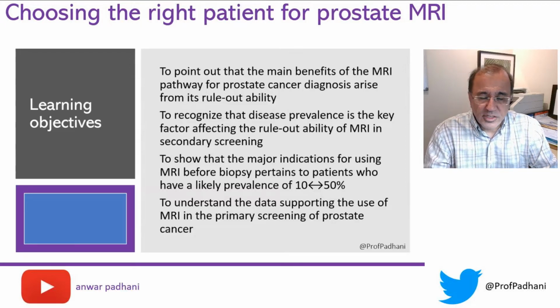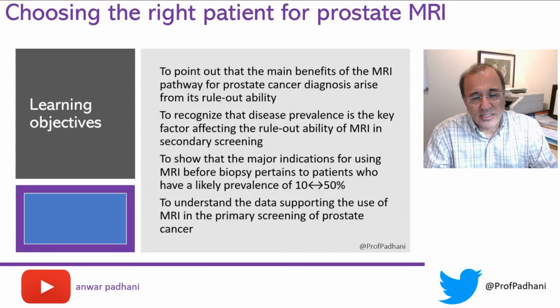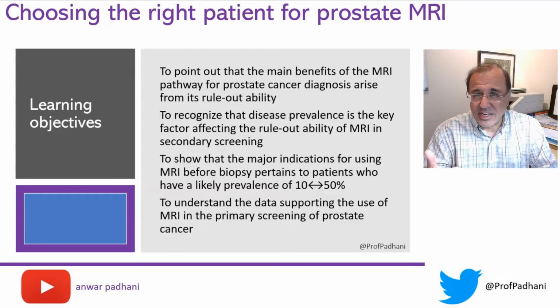And then I will follow this lastly by talking about new data supporting the use of prostate MRI in the screening setting and how it might be used in that.